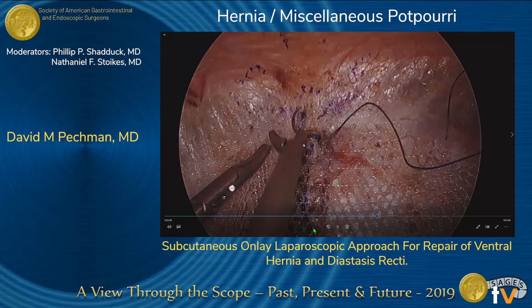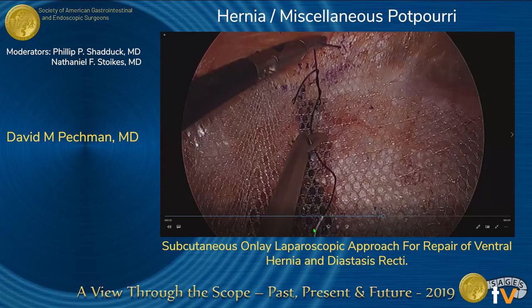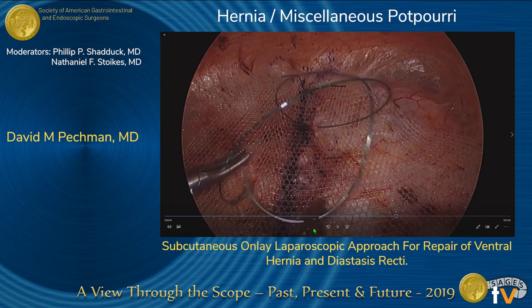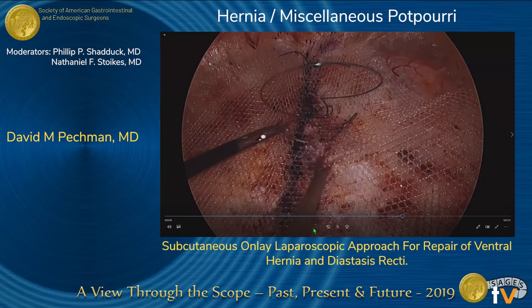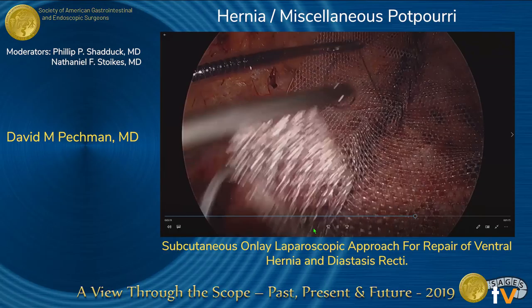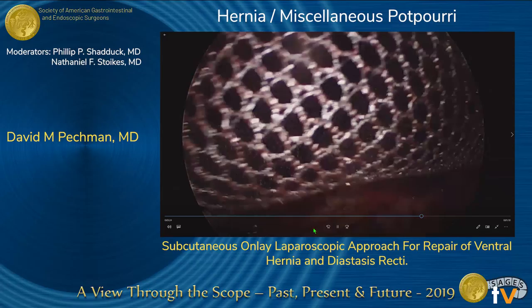The mesh was attached by Vicryl suture anteriorly and then laterally. The mesh was fixed to the anterior rectus sheath along the midline with a 3-O V-lock suture. Bleeding was controlled with continuation of the running V-lock suture.